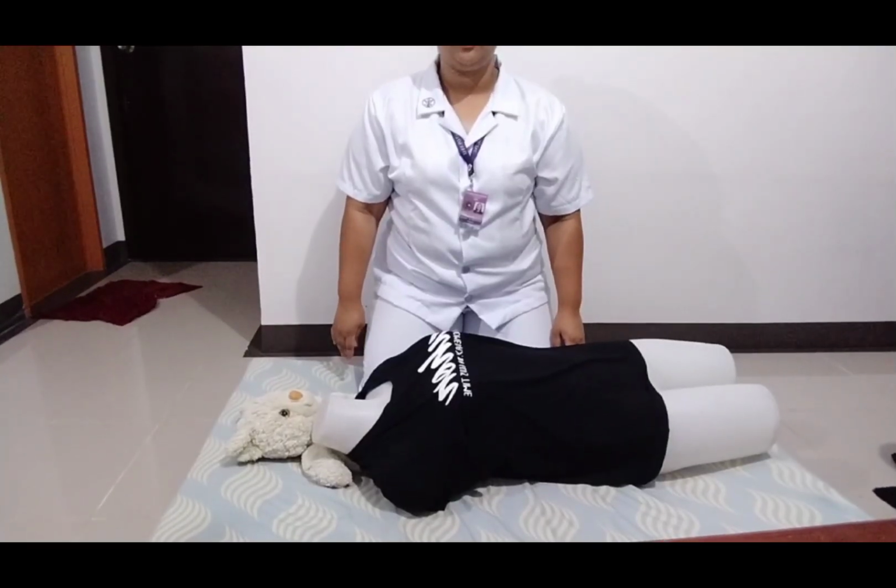And today I am going to perform the basic life support for adults, child, infants, and newborns return demonstration. Basic life support is an emergency management provided by the first responders, healthcare providers, and public safety personnel to people who are experiencing cardiac arrest, respiratory distress, or an obstructed airway.